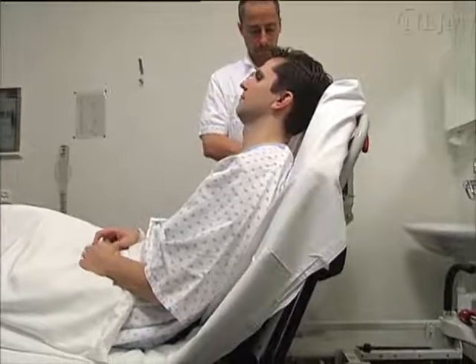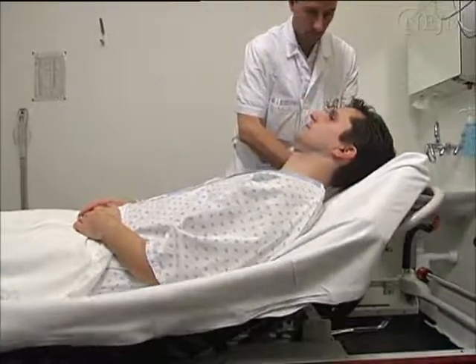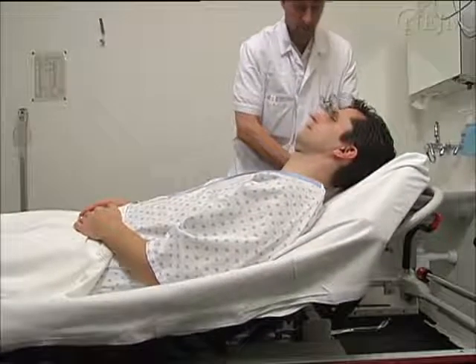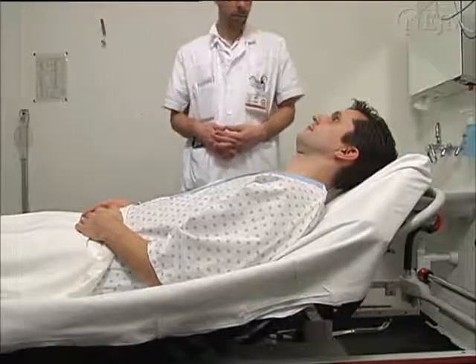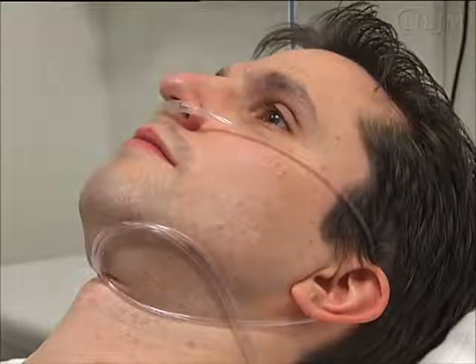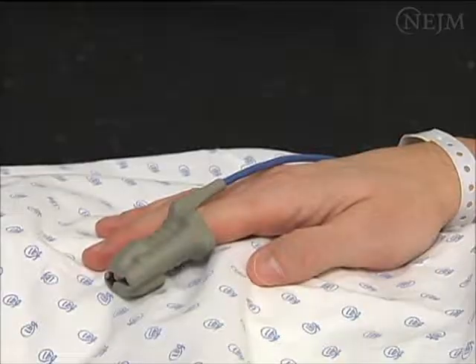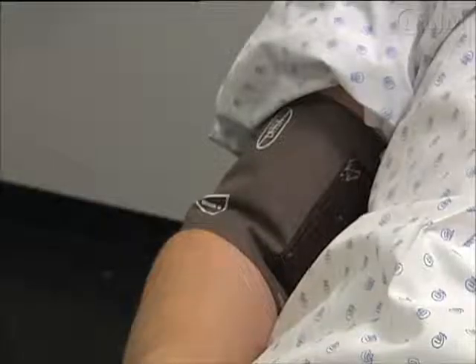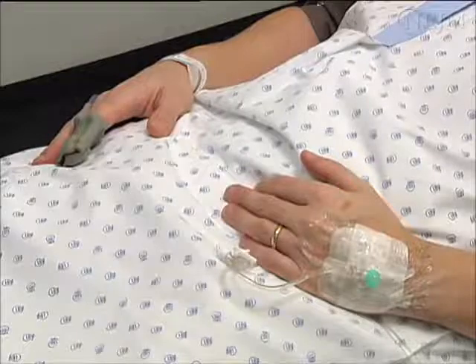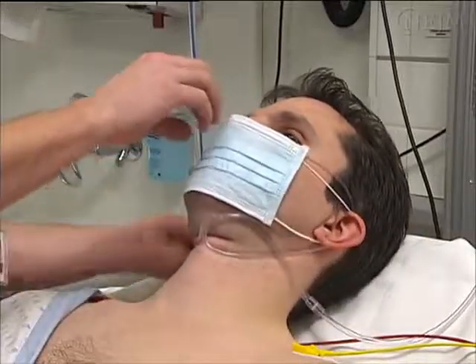Place the patient in a semi-supine position with the torso at a 30–45 degree angle to allow the air to collect at the apex of the lung. Administer oxygen and monitor the patient for pulse oximetry, heart rate, and blood pressure. An intravenous catheter should also be in place. Finally, provide the patient with a face mask.